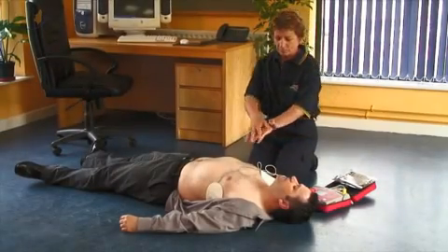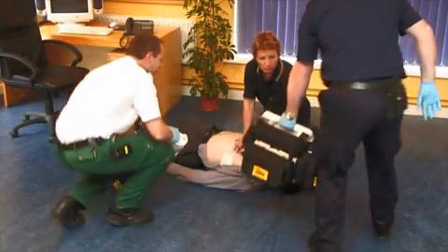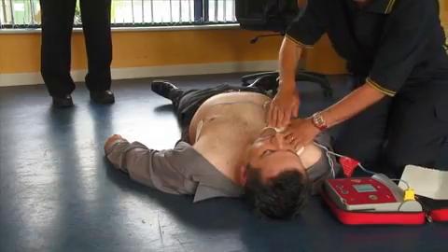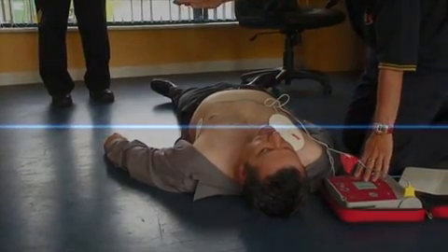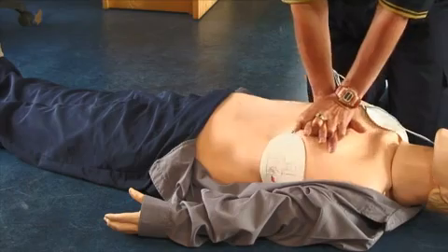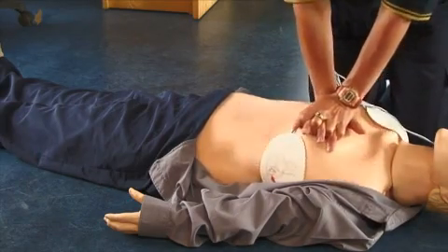One shock is given, followed by 2 minutes of CPR. Repeat this process until an appropriate practitioner arrives and takes over. A "No Shock Advised" prompt means that the AED was not able to detect a shockable rhythm. Commence CPR and continue for 2 minutes. Follow the voice prompts.